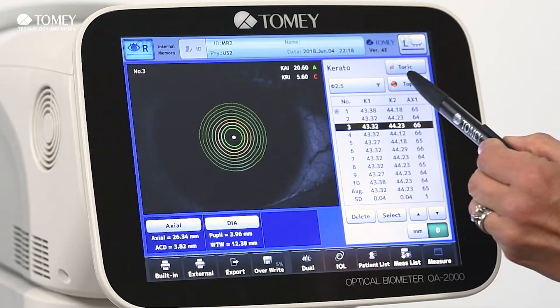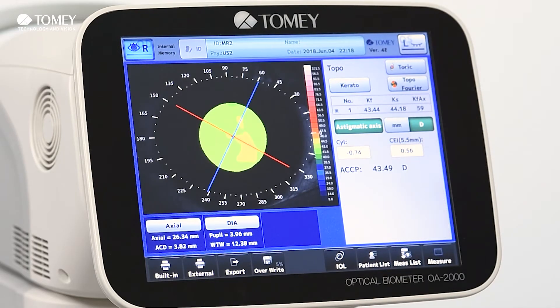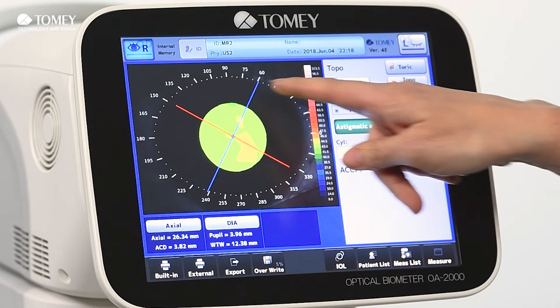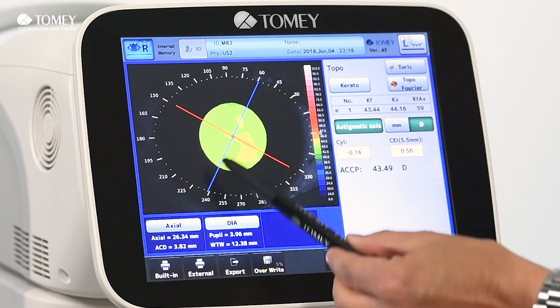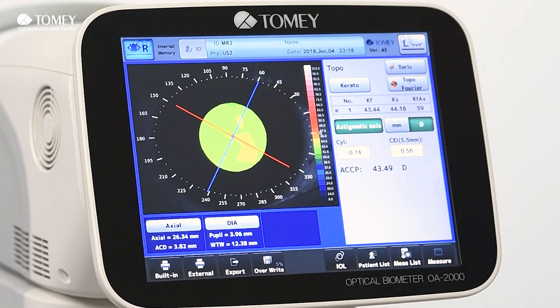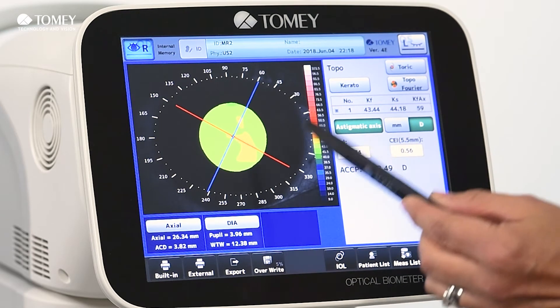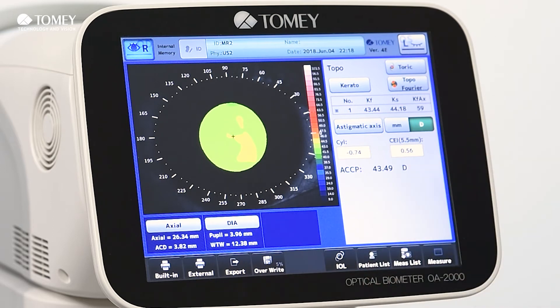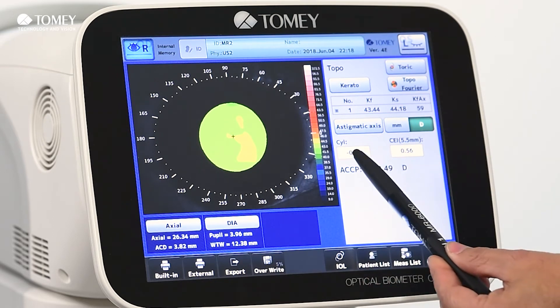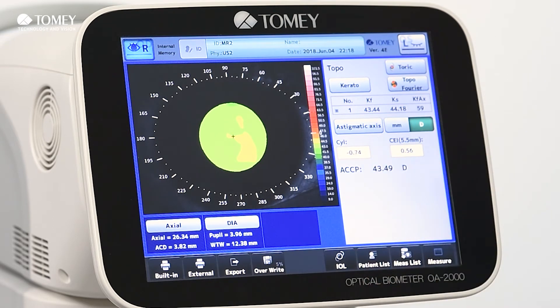When we click on topography, you can see a full display of the topography map. Additionally, we show the astigmatism axis, which we can remove with just one click to get a deeper overview, and the cylinder is also displayed here.